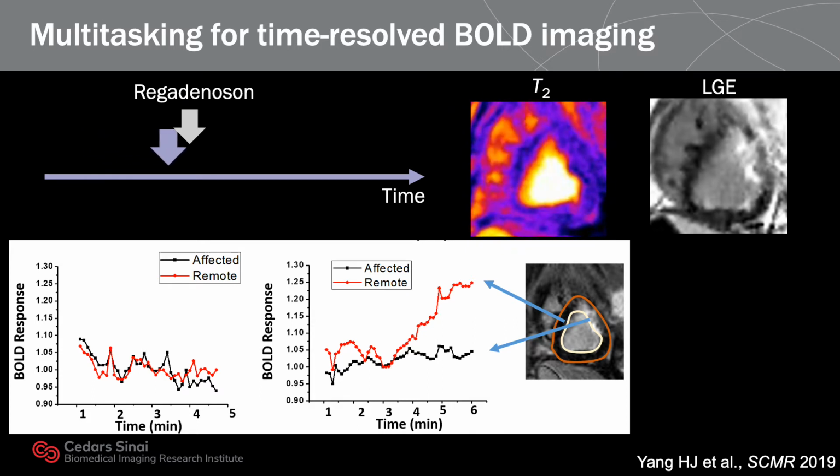We used multitasking to resolve the dynamic process of myocardial BOLD signal response after the injection of stress agent regadenoson, improving the confidence of BOLD imaging in the heart.